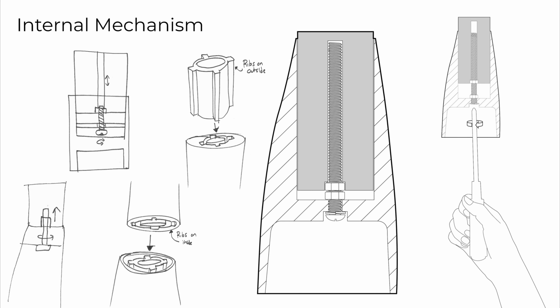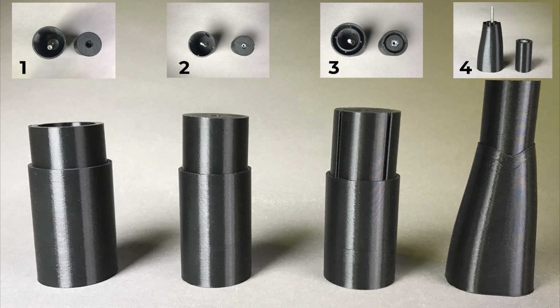By turning a bolt hidden in the socket, a prosthetic specialist will be able to adjust the length while the patient is visiting. The mechanism can be utilized in other features of prosthetics for lengthening. We developed the prosthetic over a few generations to be very secure and tight-fitting by adding slots necessary to ensure the extension would not rotate on its own.